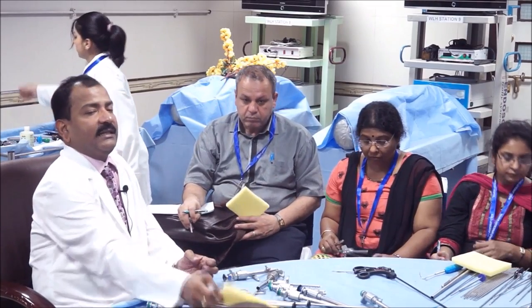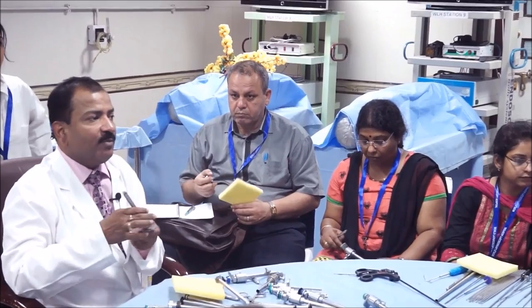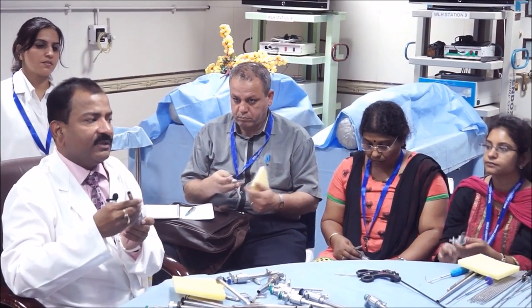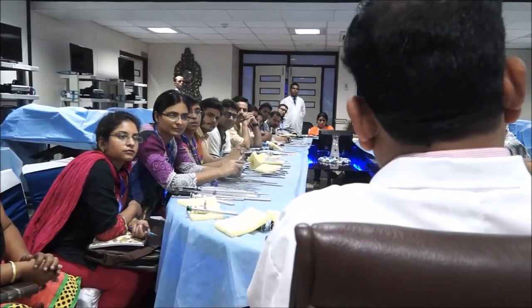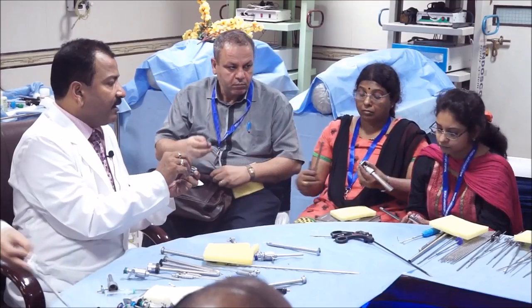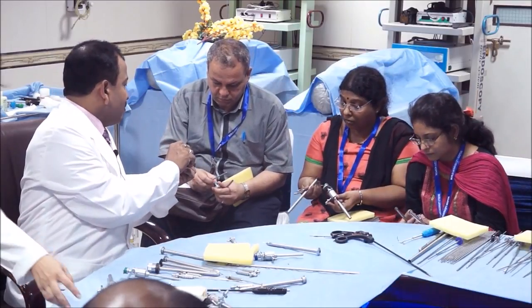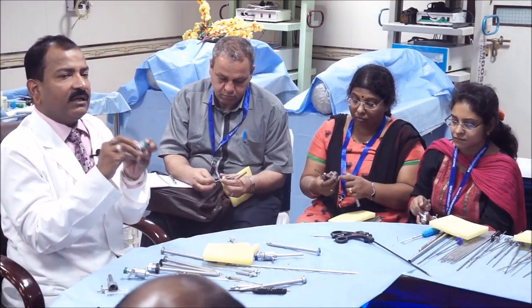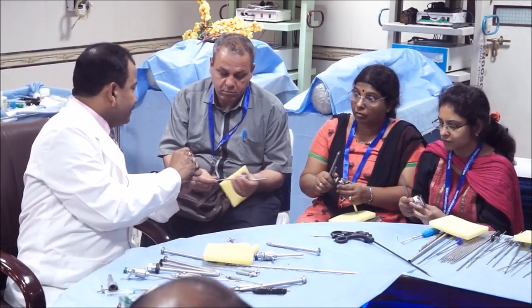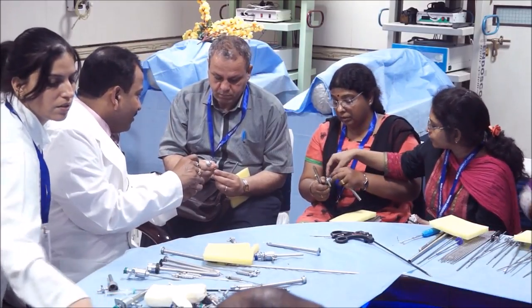Now, you will hold it like that, and the head, and this is the cannula. And the cannula has two parts, one is valve, another is shaft. This is the shaft of the cannula, this is the valve of the cannula. It is very important, open the flap, and then your cannula is not opened. Your valve has to be opened and then? Yes, inside. No, not that. That is the washer. This is on the top, this is called a washer. The seal is inside, in the valve. Yes, inside the valve there is a seal.